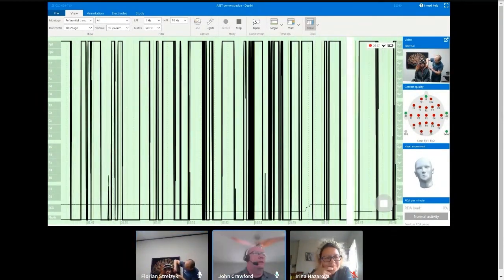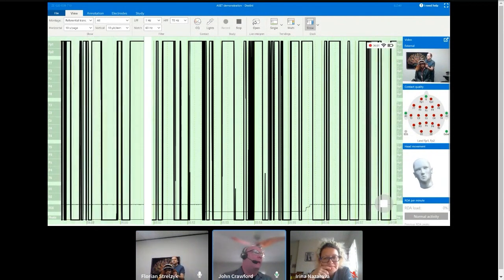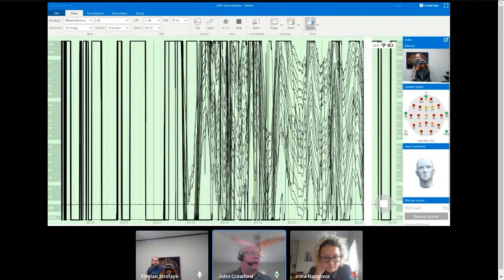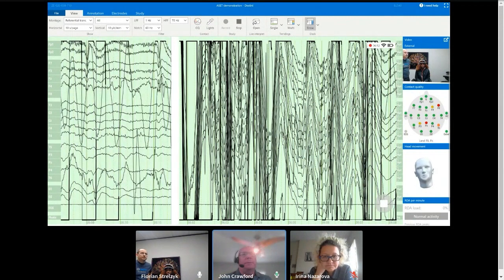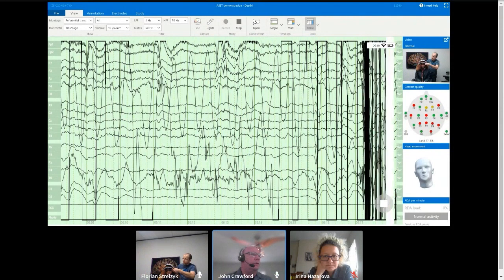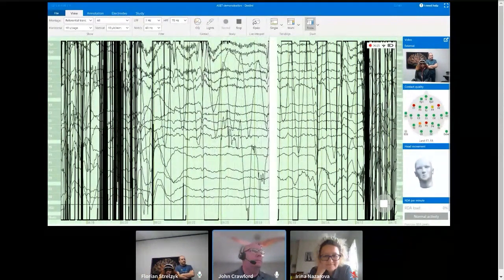From a clinical standpoint, what we very often recommend is to take an alcohol swab and swab behind the ears on the mastoids, just to remove any body oils, any conditioners, or, if you have somebody like me, lotion. I put lotion on my head, so getting that lotion from behind the ears on the mastoid would be advantageous. So now I'm just going to wait.